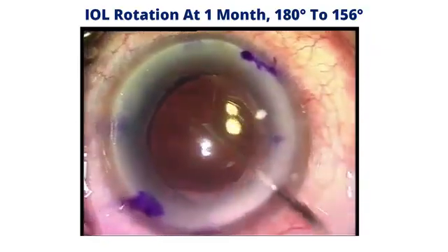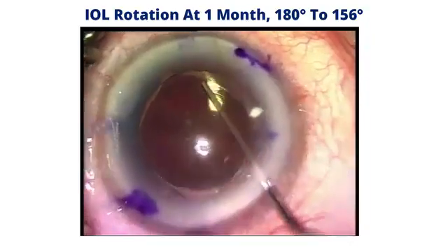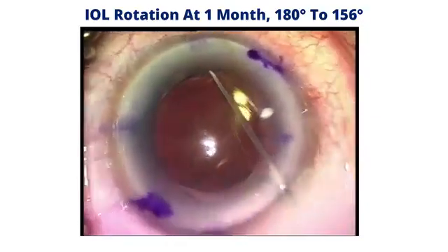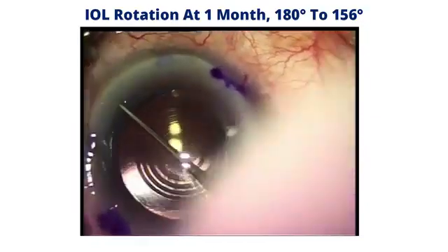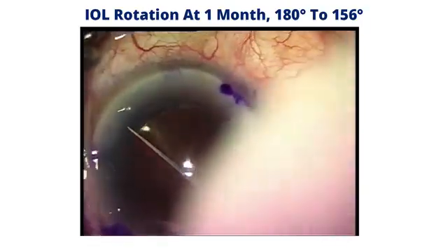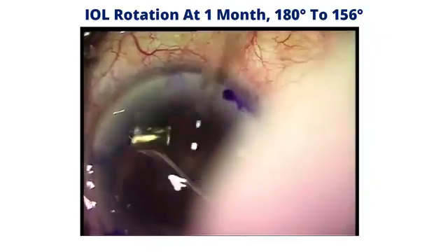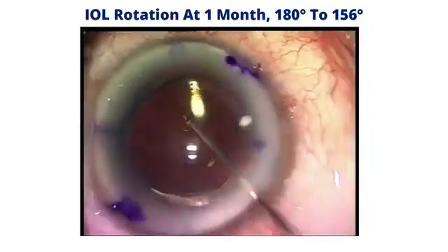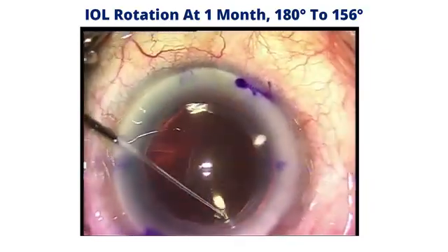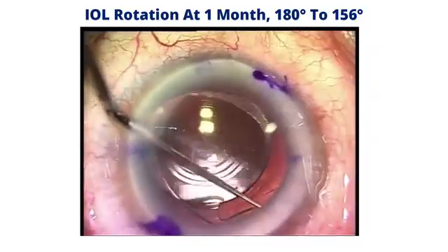Next is the Sinskey hook coming in to help to free up the haptic, and you can see, even though you're not seeing the haptic entirely, you can feel. All right, so you don't want to push too deeply so that you do not hit the posterior capsule and breach it, but you just want to latch on to the haptic and maneuver it from the haptic optic junction towards the tip. All right, you can see I'm progressively reaching the tip. Although I'm feeling it and not seeing it, I know I'm making progress, and now you begin to see it.